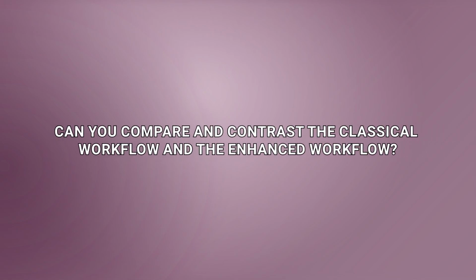So radiology has more of those screening tests. This cytology test for cervical cytology is one of the few that we have that are more screening than diagnostic. And to me it was always, okay, AI is a perfect help for a screening test, because the current workflow, and I'm going to ask you to elaborate on this, the current workflow is the cytotechnologist screens and then shows stuff to the pathologist, right? Can you compare and contrast the classical workflow and the enhanced workflow?